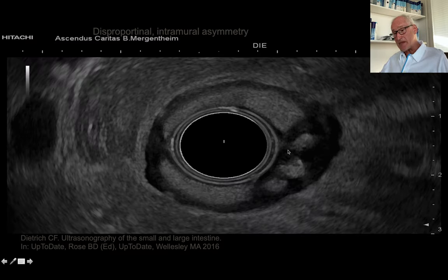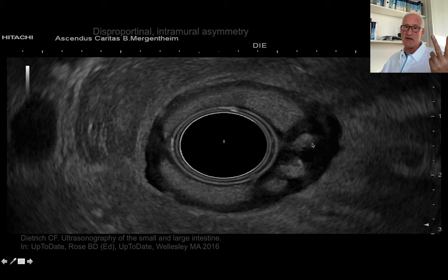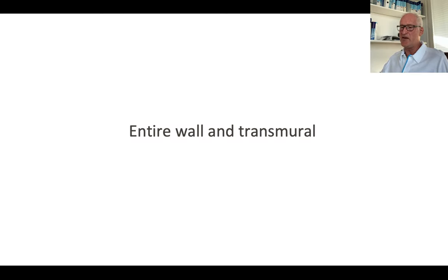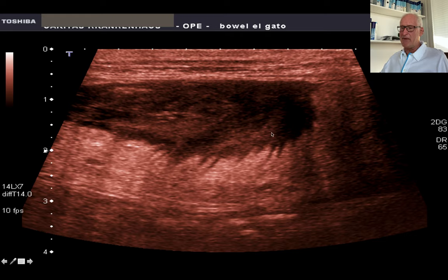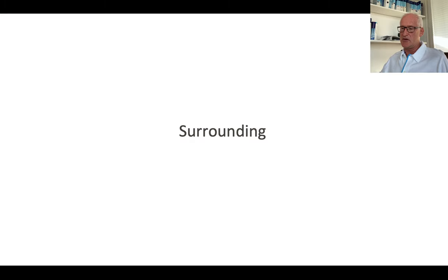By endorectal or endoluminal ultrasound, you can see the asymmetric involvement of a certain part of the entire bowel wall. This typical disproportional, asymmetric thickening shows the typical features of Crohn's disease. The entire wall can be inflamed with some loss of bowel wall structure, and you can see early transmural inflammation, early fistula formation, and surrounding tissue involvement — a unique specification of high-resolution ultrasound.